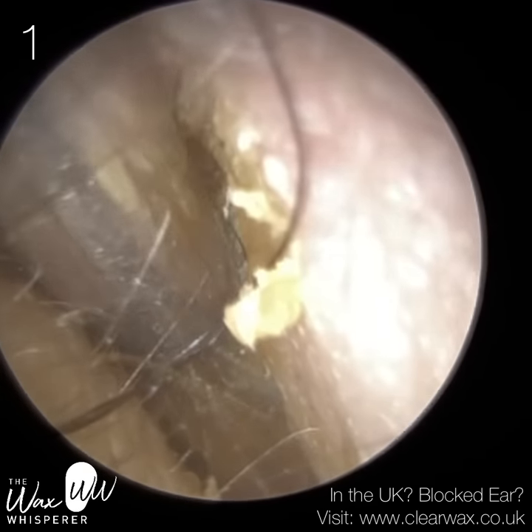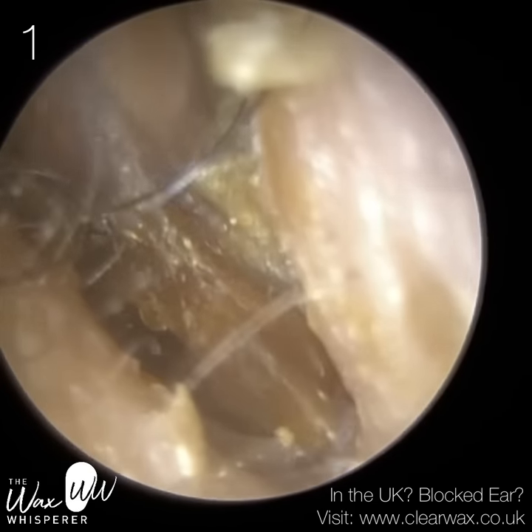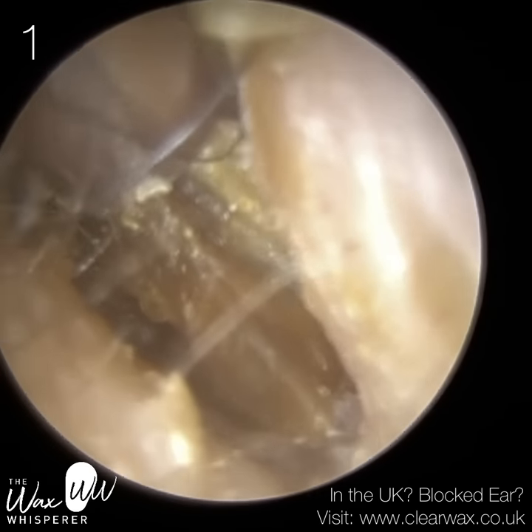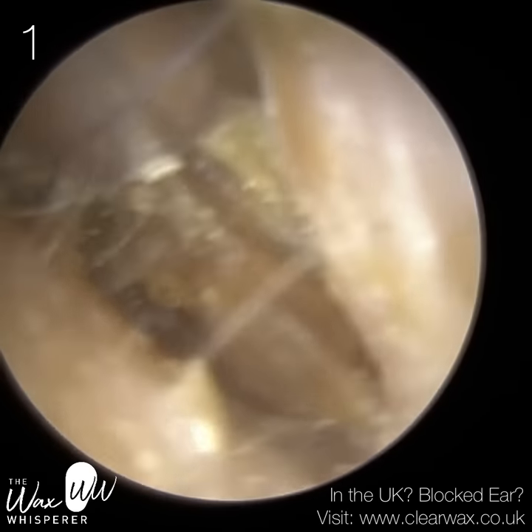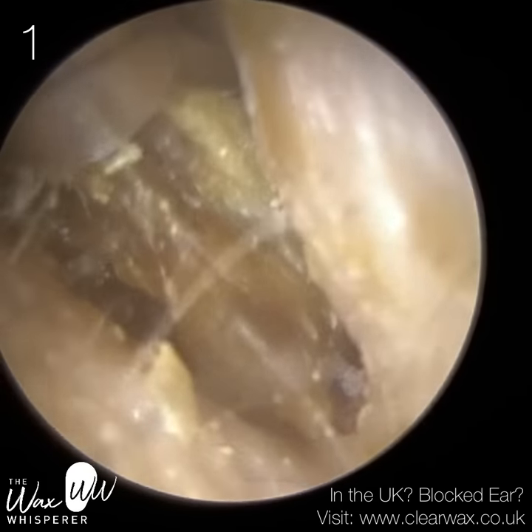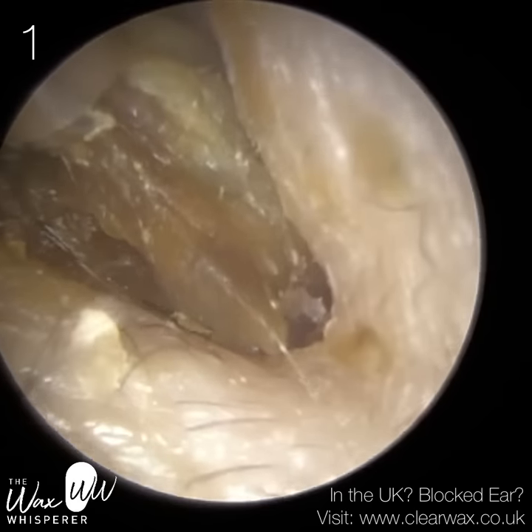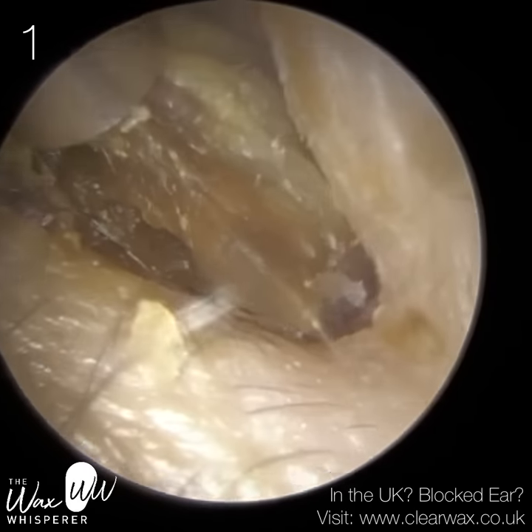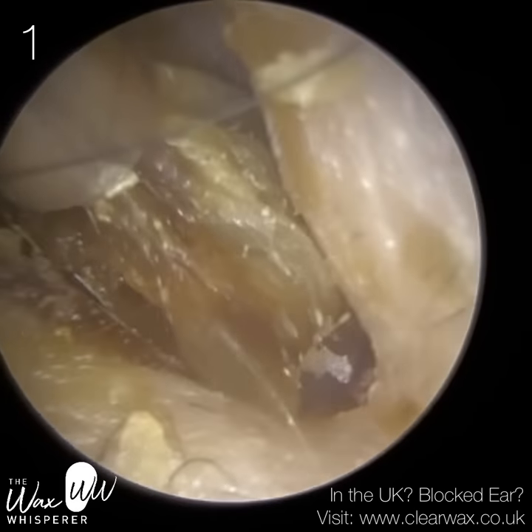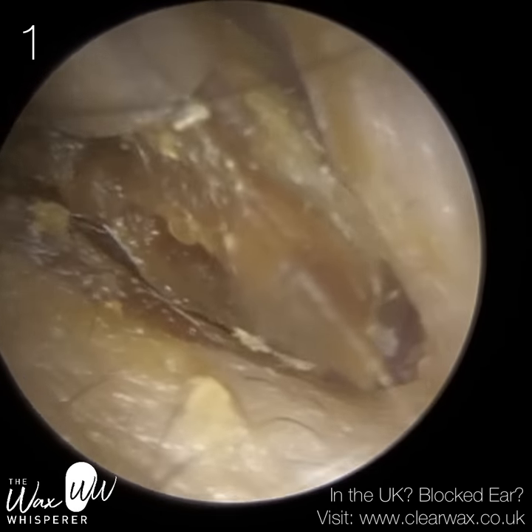This video has encapsulated three separate visits. Unfortunately, my auntie is suffering from an ear infection — more specifically, otitis media with effusion. Otitis media means a middle ear infection, and effusion is fluid. So she's got an infected middle ear cavity with fluid buildup. In addition to that, you can see she's got a lump of really dry wax keratin at the entrance of the ear canal.